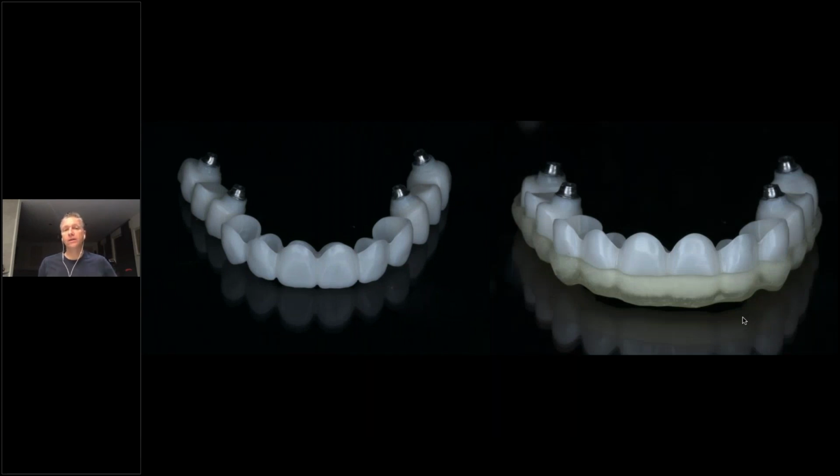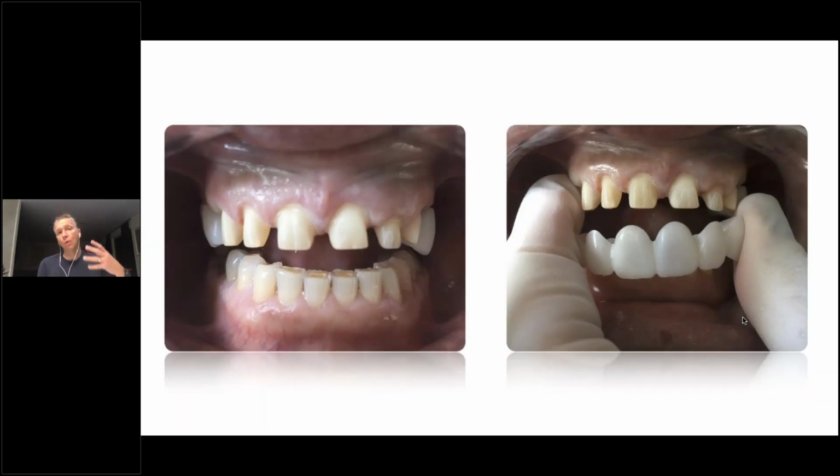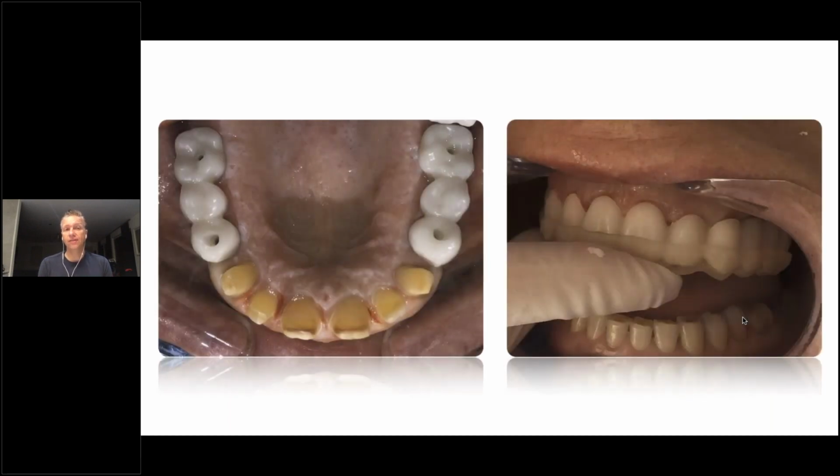In reality, on the day of seating, the doctor prepped the upper anteriors. She then seated the upper posterior implant bridges, opening up the implants and seating the bridges, without adjusting the occlusion yet. On the right side, you see her retrofit the temporary shells over these preparations. That means slightly adjusting the preparation and the temporary shells to make sure it sits nicely and passively. The passive fit is very important. And here is an occlusion shot, where you see the screw-retained bridges and the preparations.